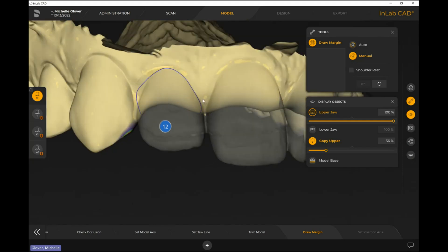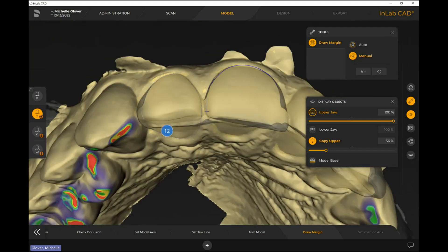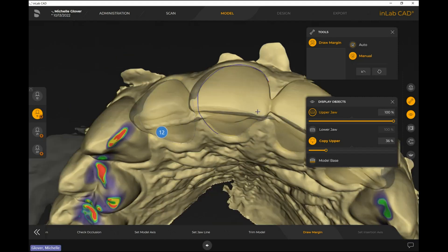I can easily fix any margin line adjustments needed. Moving on to tooth 1-1, same thing — I change to manual, create the margin line, making sure those lines don't intersect with each other in the contact region. You just duplicate this process for the next few teeth.